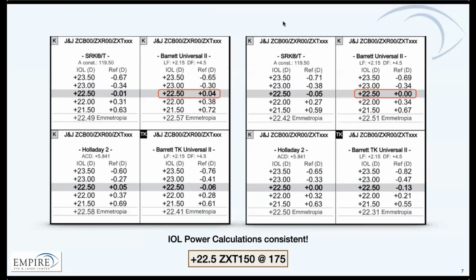Outstanding. Sumitra, any comments? Yeah, I think it's a great point about the fact that there can be peripheral pathology in the cornea that causes irregularities to the tear film. And this patient has probably had this pterygium for a while. It's not growing. Why necessarily do anything about it? But if you hadn't gotten good measurements in a row, then you would have said, well, it's time to remove the pterygium. So I think that was a really great example of how it can go in totally two different directions.